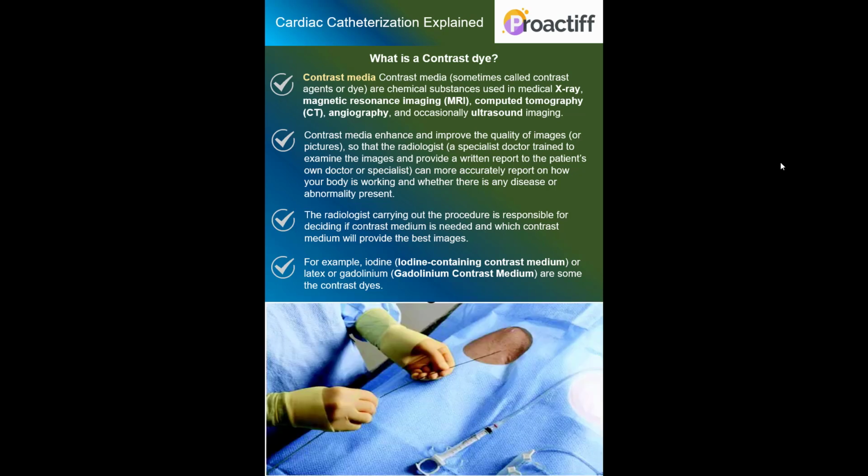As you can see here in the picture, the wires are being inserted through this small hole. This is a delicate procedure that the specialist would do. So this gives you a perspective of what cardiac catheterization is and what is involved.